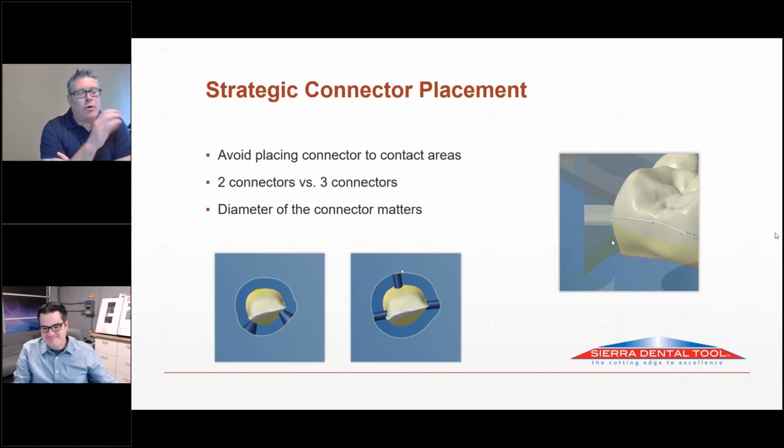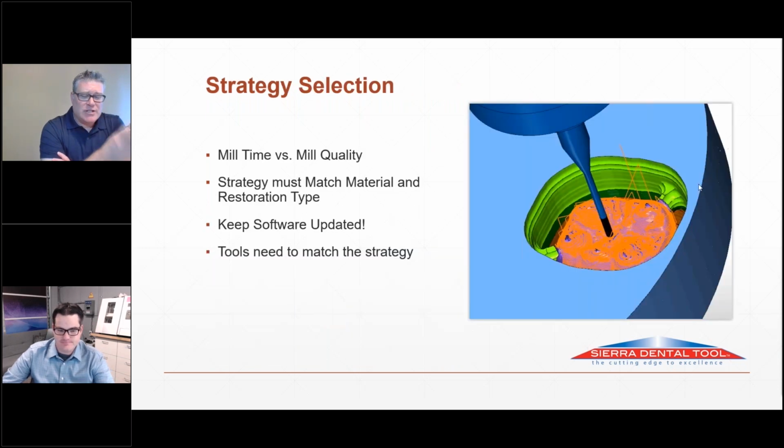And that's the thing is, we're going to move on to when we get into after nesting, when to start finishing the units, finishing them down in the green state. So we'll step onto this one. Now, the next thing is milling strategies.